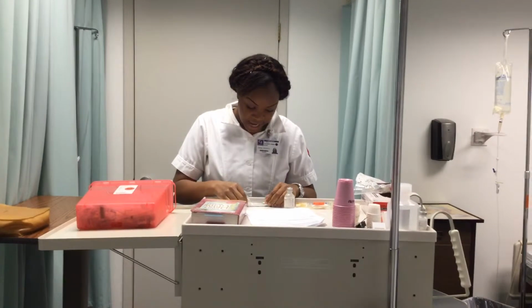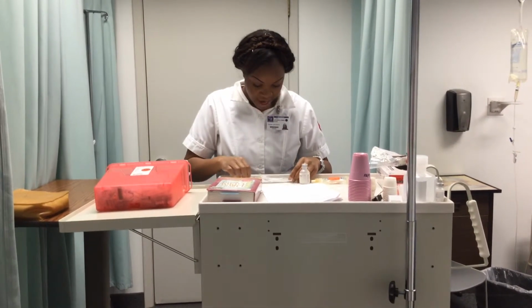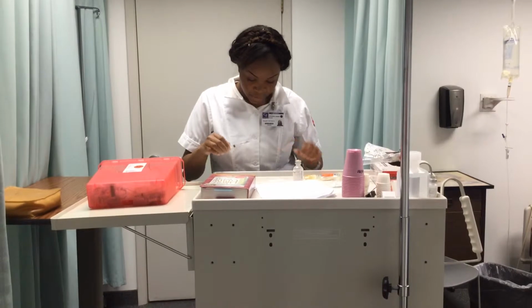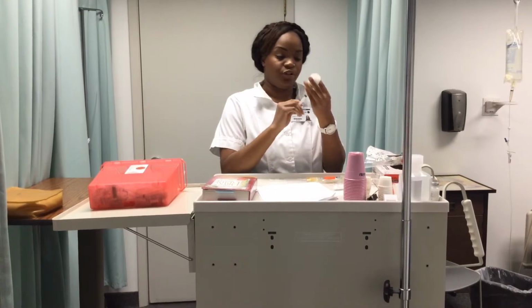While the medication is in the wrap, I'm going to go ahead and pull back 2 mLs of air. Maintaining sterility, I'm going to go ahead and inject the air into the medication, and I'm going to pull back my medication, my 2 mLs.